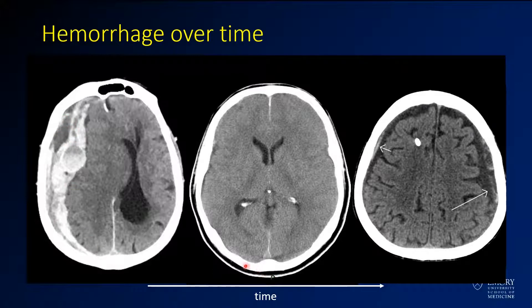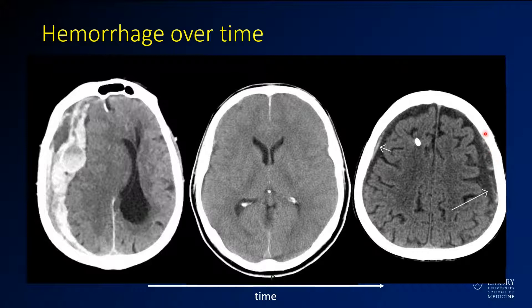Over time, taking a couple of days, you still have a subdural hematoma here, but it's very isodense now — you almost can't differentiate it from the adjacent brain. Over time, this will become much more like CSF. This imaging is very similar to the adjacent CSF. This is the appearance of chronic subdural hematoma.